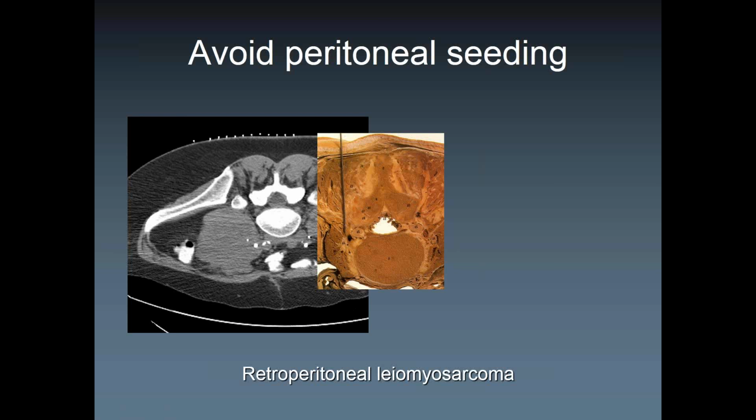If patients cannot tolerate that, then just put them on the side. It's usually better tolerated for patients who have breathing problems, for example, right, or need access to airways. You do that. That's a picture from a biopsy book that shows you what the needle would go through. So usually people think that the retroperitoneal muscle groups are pretty safe to go through, and they usually are. However, they do have blood vessels too. So it's not very well seen, but here, for example, or there.